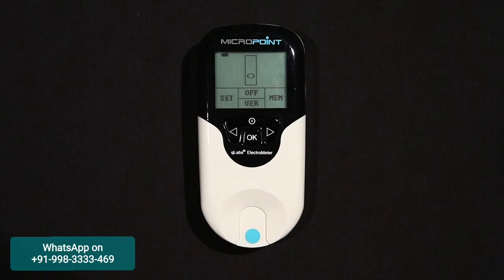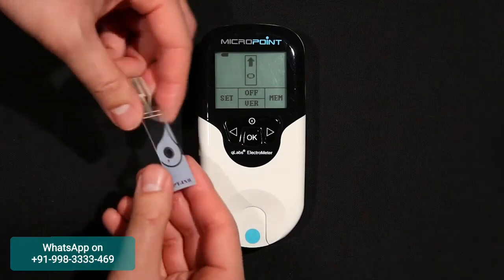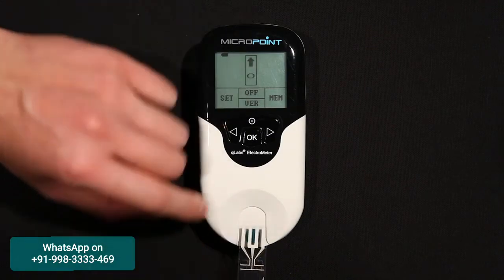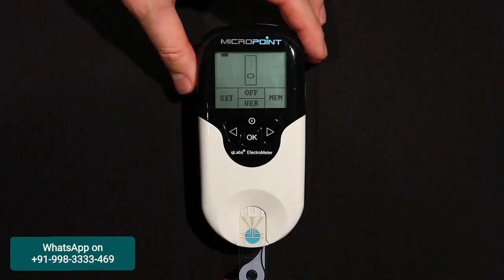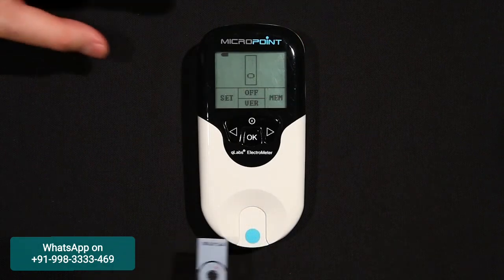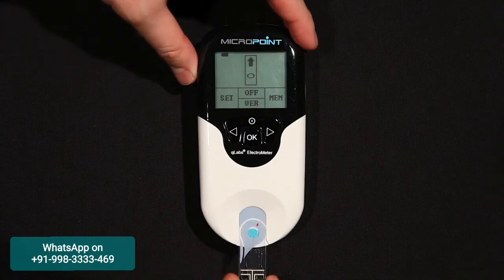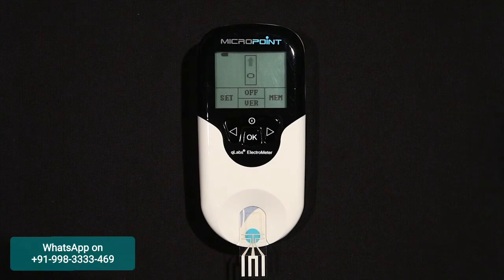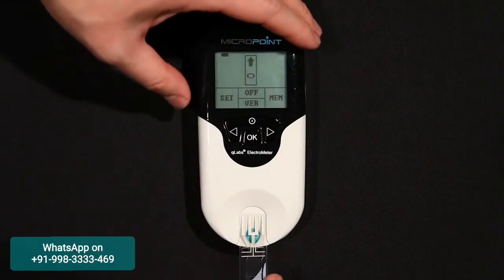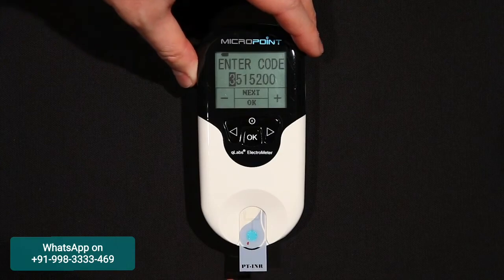When performing a test, the Q-Labs Electrometer should be operated on a level surface that is free of vibration. Testing on an uneven or unstable surface may cause inaccurate results. Insert a fresh test strip into the test strip guide with the PT-INR logo facing right side up and the electrode leads going into the Electrometer. It is very important to insert the strip the correct way. If you do not see the display prompt to enter a strip code, you likely inserted the strip upside down. Remove the strip, turn it over, and reinsert it. When the strip is inserted correctly, you should be able to read PT-INR from left to right.